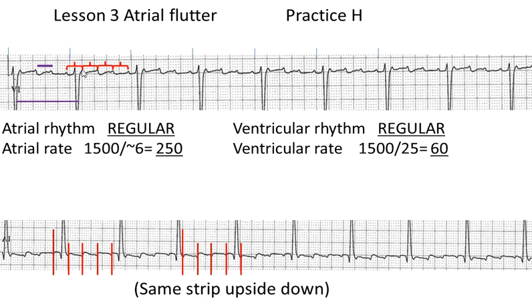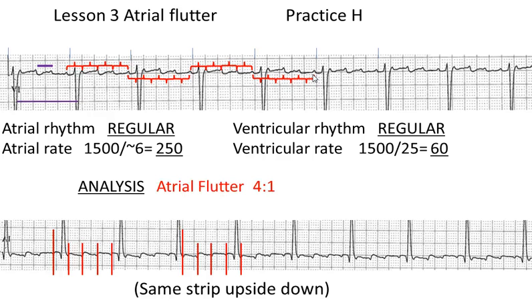Starting before the QRS: flutter wave number one, two, three, four — four flutter waves per QRS. In the next set, starting at the same place: one, two, three, four. Again: one, two, three, four. And again: one, two, three, four. This is a stable rhythm of four flutter waves for each QRS throughout the strip. Our answer is atrial flutter with a constant ratio of four-to-one atrial impulses per each QRS.